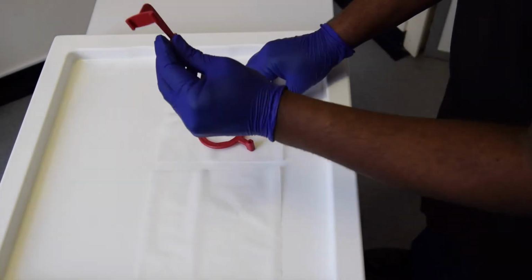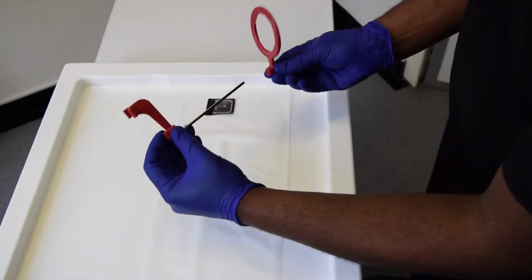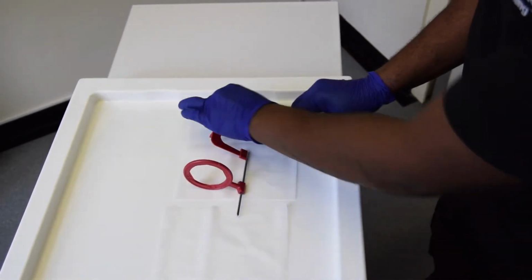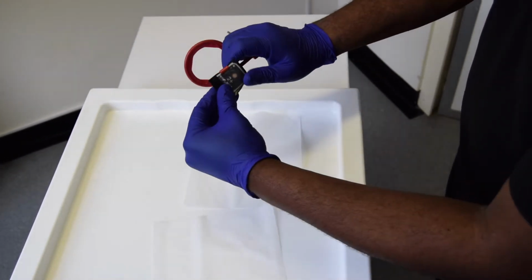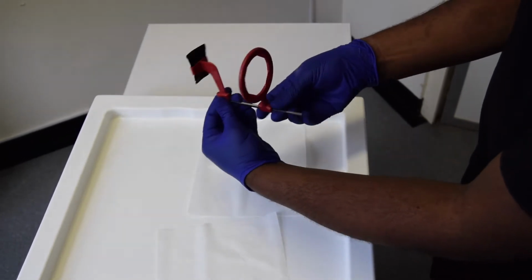To assemble the bite wing holder, the holder must be attached to the indicator or the bar. The ring must be attached to the indicator. The image receptor is then attached to the holder, and the blank side of the image receptor must face the X-ray.